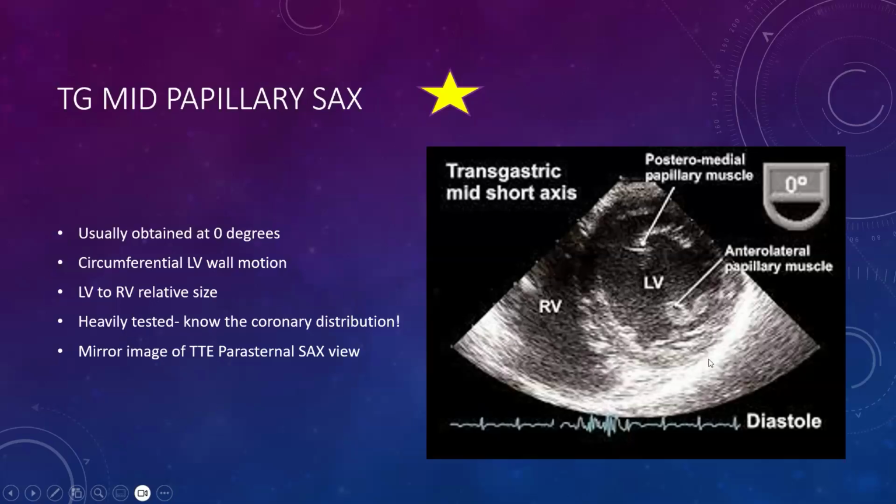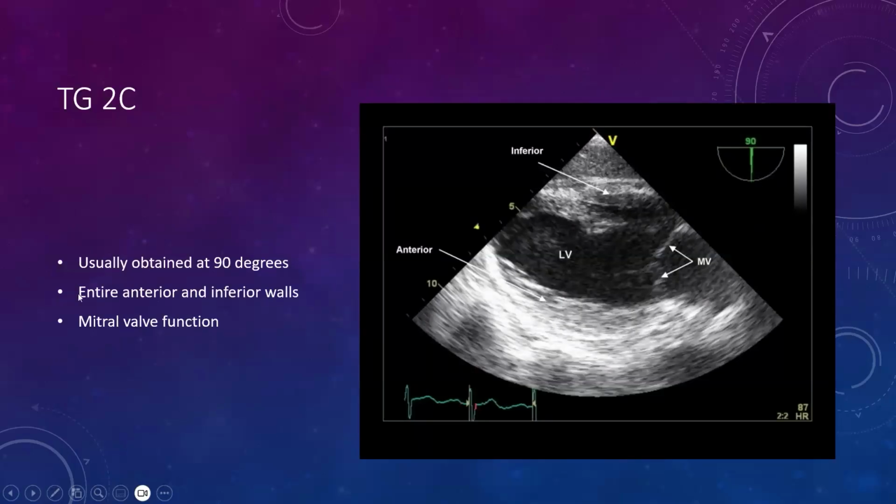But the other caveat to that is you're only evaluating the cardiac function at one slice of the dancing donut, right? So if you have basal hypokinesis, if you have apical ballooning, you're not seeing this. So I tend to combine this with that X-plane function, and it allows you to see one view and then an orthogonal view. I combine it with a transgastric 2-chamber.